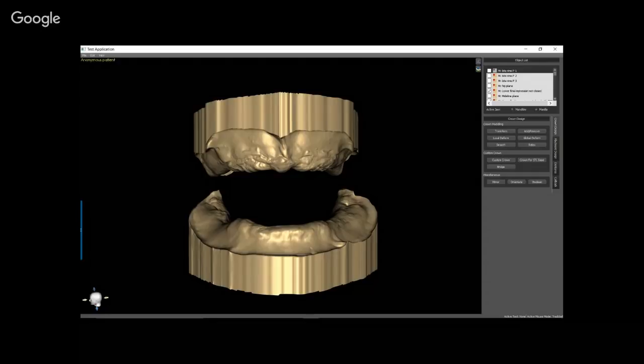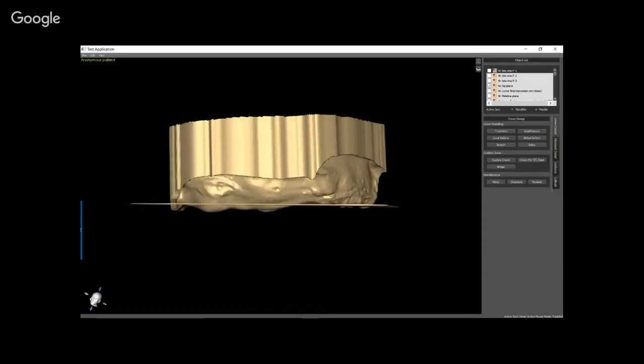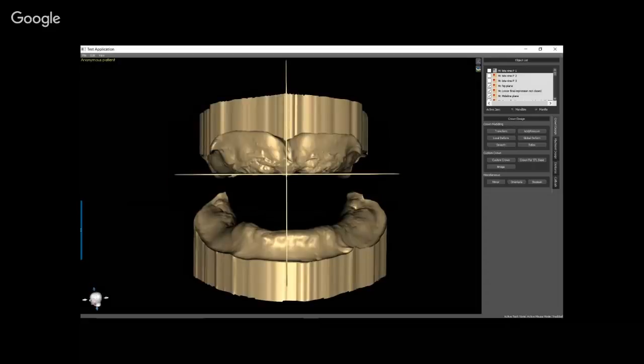It's incredible. I don't exactly understand how all of it works, but one of the things they do is base the occlusal plane off of what's known as the HIP plane, a plane generated by the hamular notches and the incisive papilla. That's what you see right here, I'm establishing that plane. It's passing right through the incisive papilla and through both hamular notches. That generates a plane which should be roughly parallel to the occlusal plane. Now what about midline? I went right through the incisive papilla and then posteriorly through the mid-palatal suture, and that gave me my midline. And again, this is all experiment.